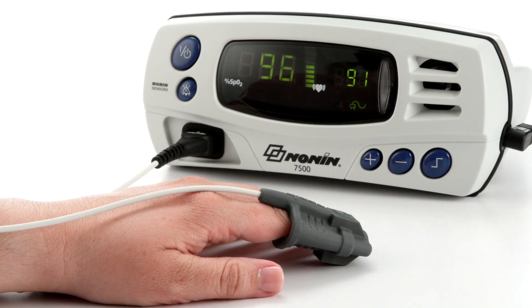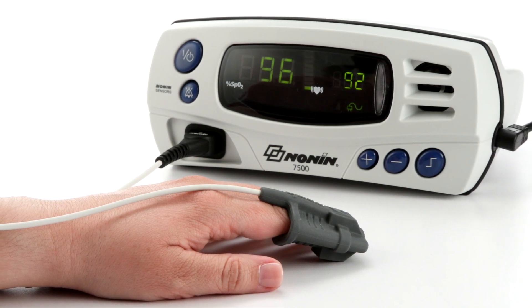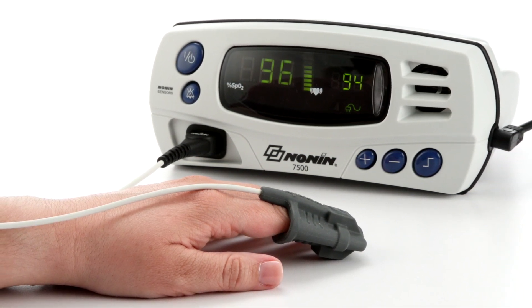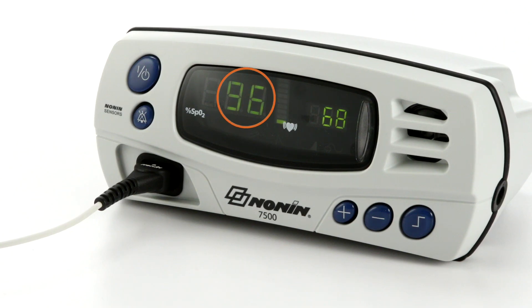After the startup sequence, the oximeter will start displaying and recording SpO2 and pulse rate as soon as the sensor is placed on the patient. The SpO2 level is shown on the left side and the pulse rate on the right side. The pulse strength signal bar in the center indicates the signal quality.